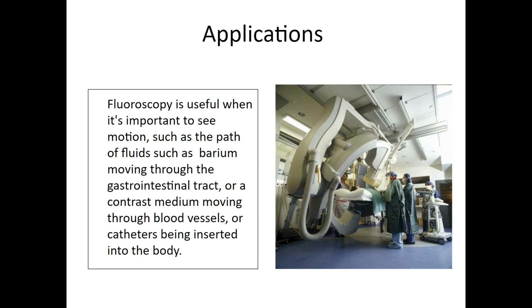Anyone know why? What can you see that's basically in the middle of the image? If you took a dart and threw it at pretty much the middle of the image, what might you hit? It's just to the right of the monitors, but it's actually closer. See this thing right here? That's not our clunky image intensifier tube. That's a digital fluoroscopy tube. So it's square. They basically work in a similar way, but the digital quality is better, of course. But we'll get to that when we get to it.